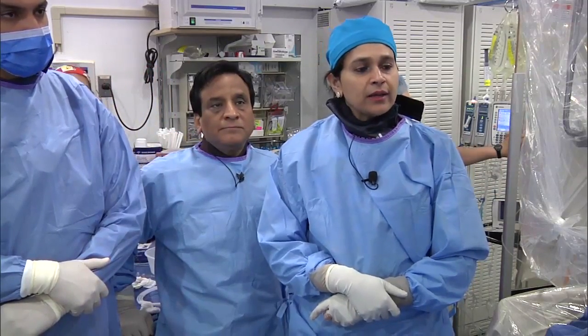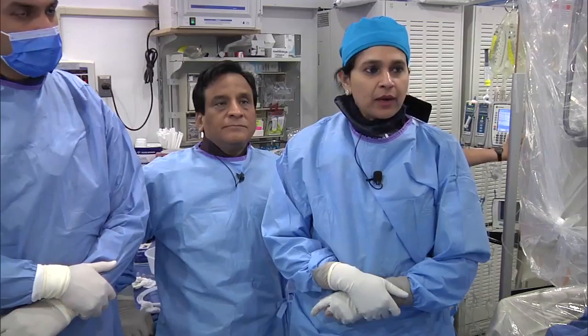That's how I could enter into the LAD with the Miracle. And same thing, it was subintimal. Now that this has happened, how do you pierce the subintimal cap and go to the true lumen? And this is where your Confianza would help.